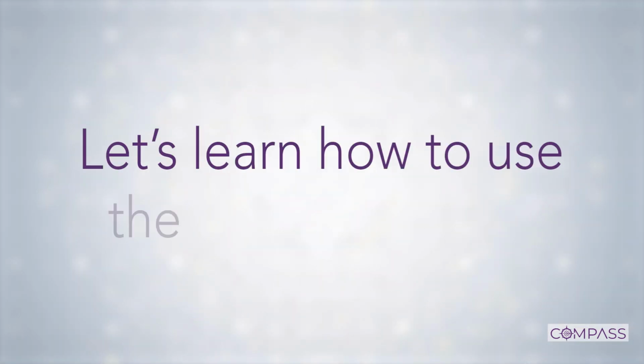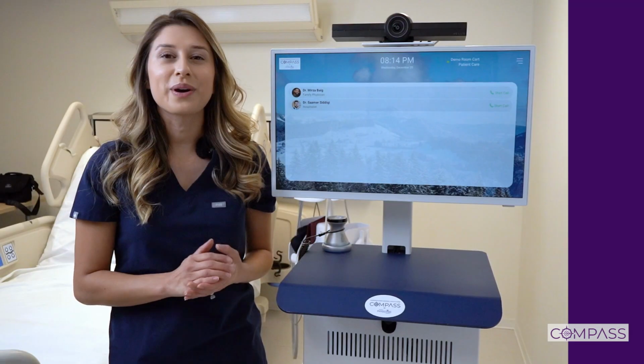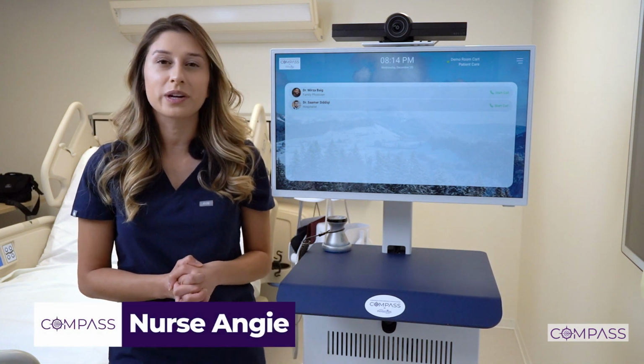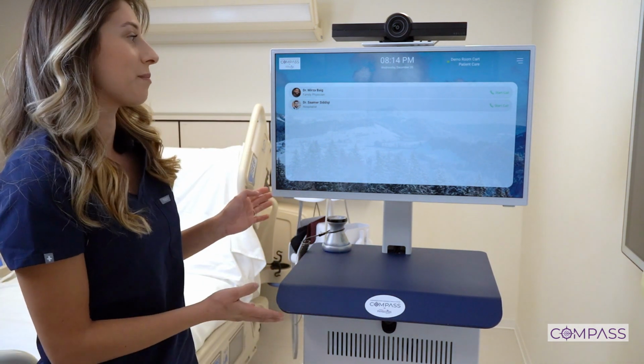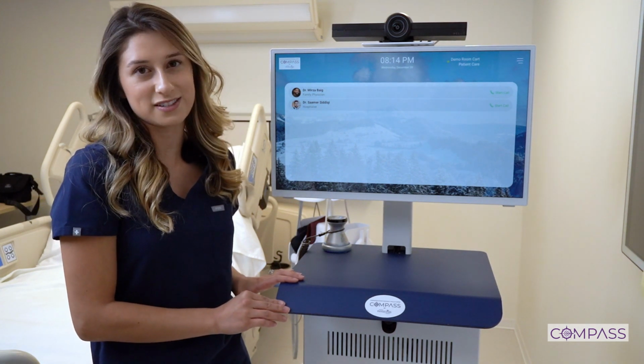Now, let's learn how to use the Compass cart. To provide us with a quick walkthrough, here's our resident nurse, Angie. Hello and welcome. My name is Angie and I'm going to be your nurse for this tutorial. We're going to be learning all about how to use Compass. This is our digital health device for virtual specialty consultations.